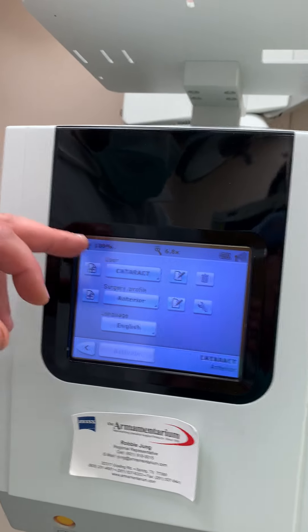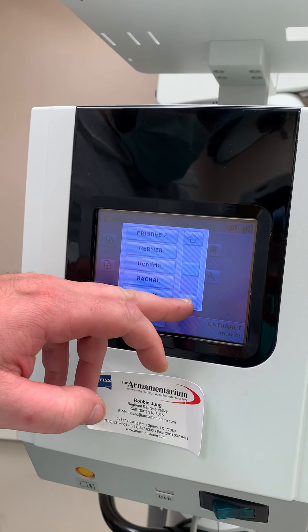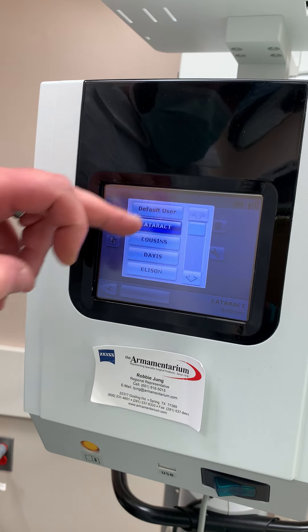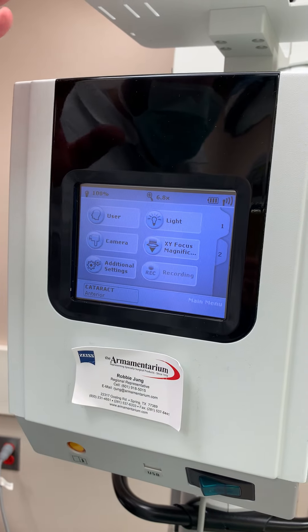Some facilities use different users. To switch users, you go to User. You do have different users in here, so just select it and then hit Back. It'll reload all the settings that you have set in there.